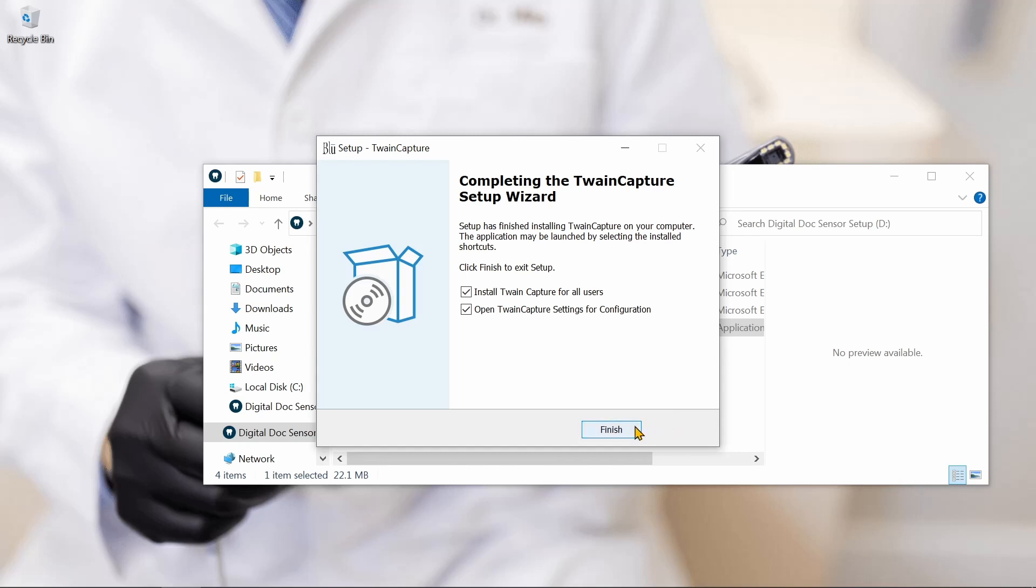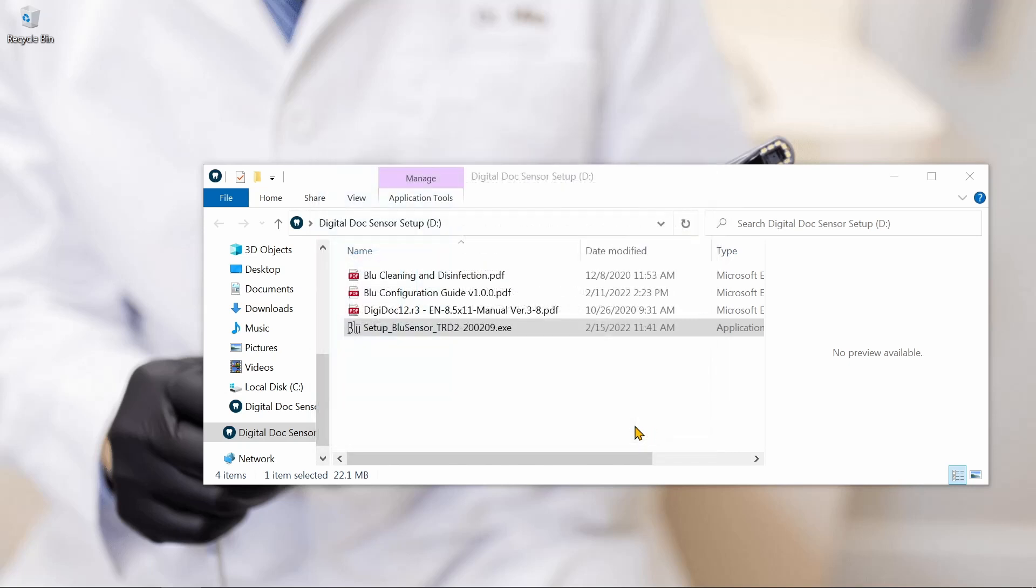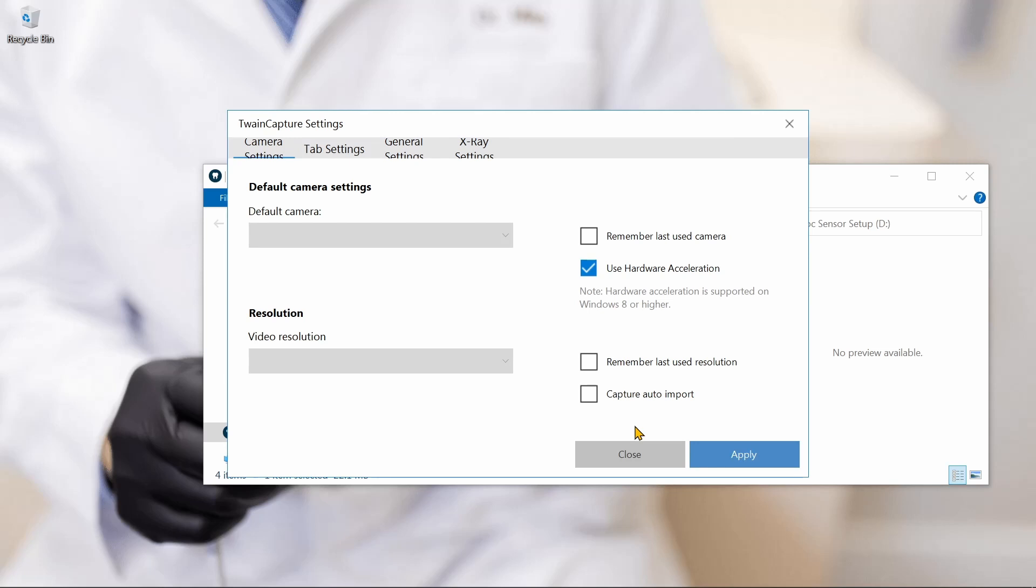Once the installer is complete, we'll click Finish, and that will prompt us with these settings for the Twain driver.